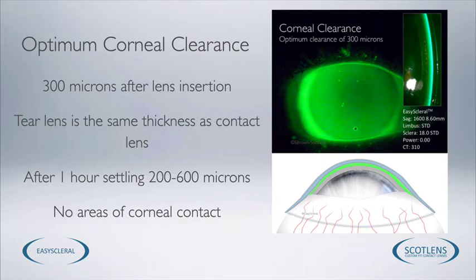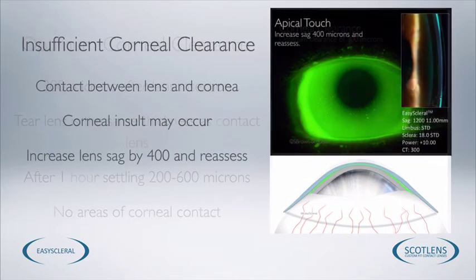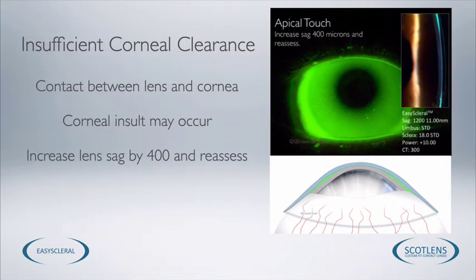The most important thing is we don't have any areas of corneal touch. In this image we can see that we have got apical touch, so this is an inappropriate fit. We want to increase the amount of corneal clearance, insert a new lens and reinsert.